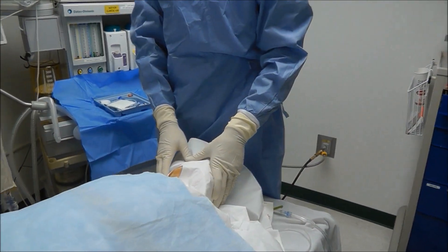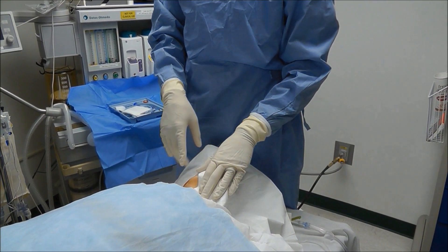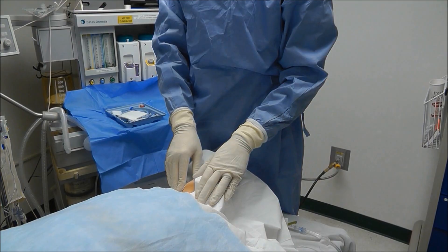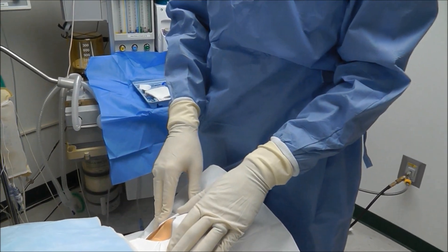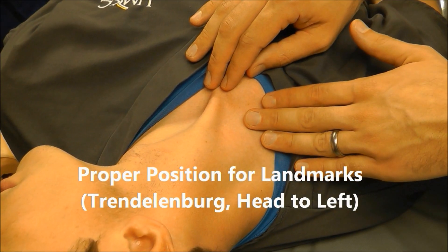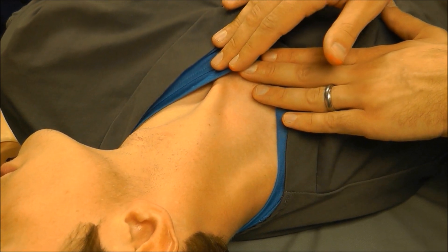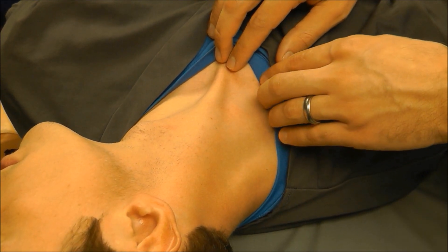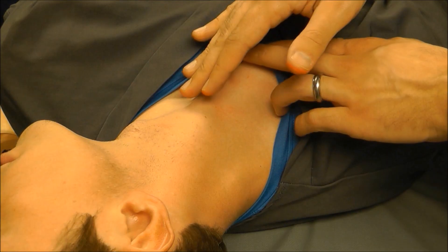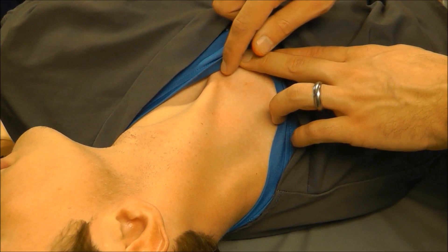Now that the patient is prepped and draped, it's time to insert the needle at the appropriate landmark. Let me show you those landmarks real quick and then we will do the central line. We put the patient in Trendelenburg and then have them turn their head slightly to the left if we're doing a right IJ, because that aligns the anatomy to where the IJ is usually lateral to the carotid.